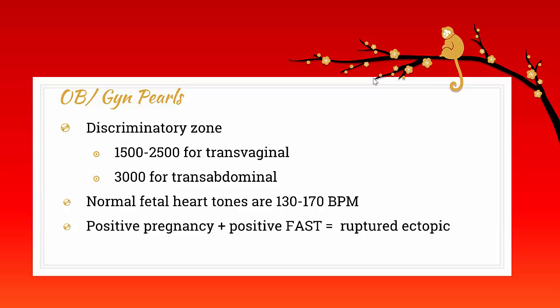It's also important to remember normal fetal heart tones are generally 130 to 170 beats per minute, though there is some variability with age of the fetus. Any question stem with abdominal pain, syncope, unstable vitals, or vaginal bleeding with a positive pregnancy test and a positive FAST exam is a ruptured ectopic until proven otherwise. Accordingly, OR and OB consult will be the proper management.